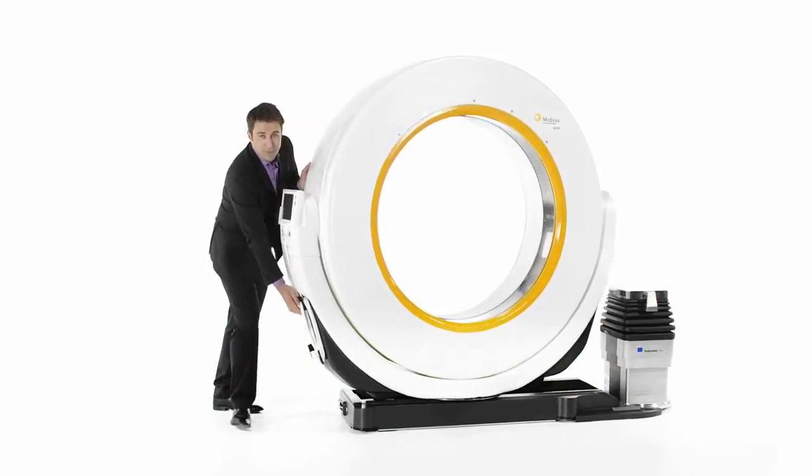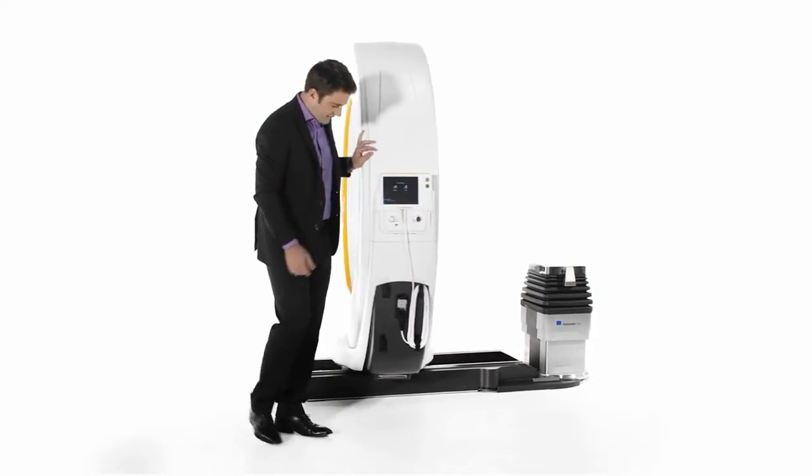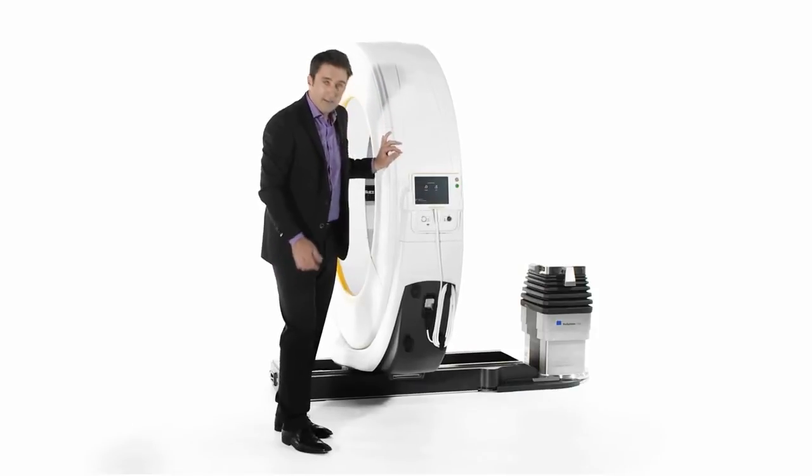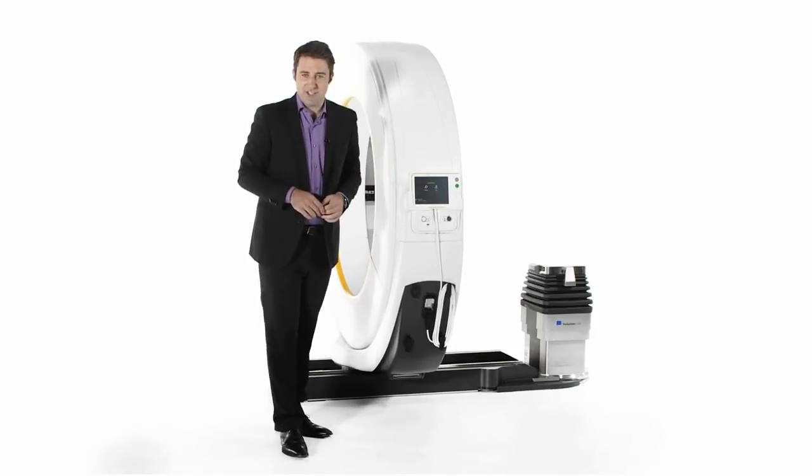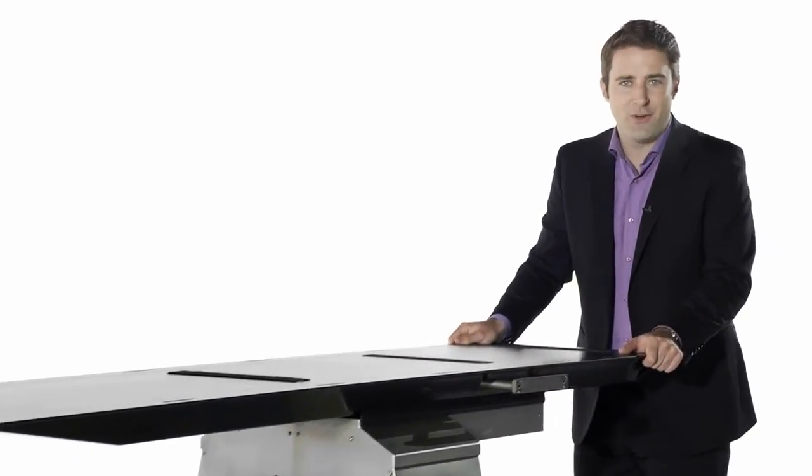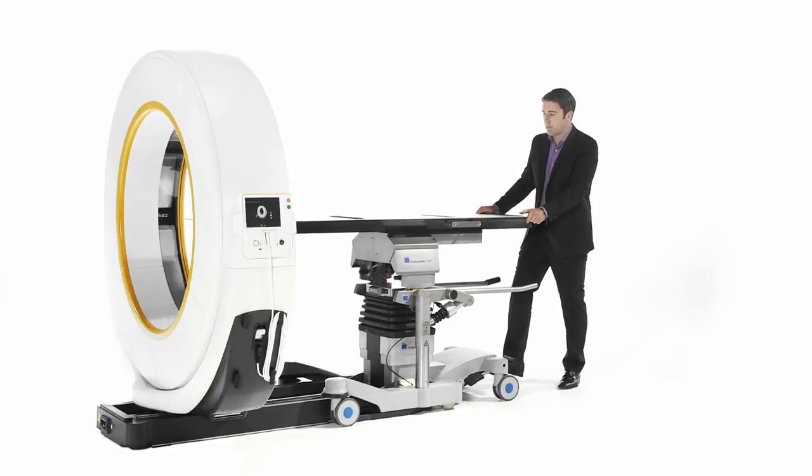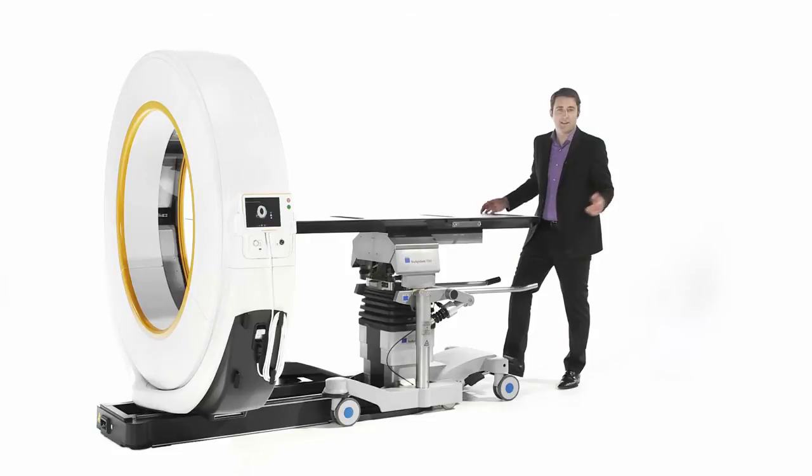Once in the treatment room, Aero is connected to a standard outlet and the gantry is rotated. Aero is ready for patient positioning. The integrated Trumpf-LR table system offers all the radiolucent components and capabilities of a high-end surgical table, from carbon-flat to articulating multi-sectional.